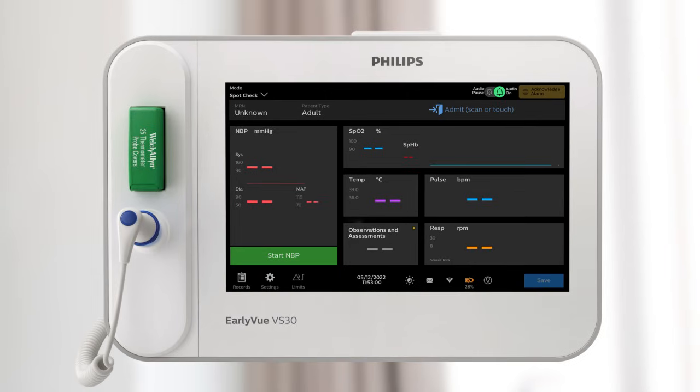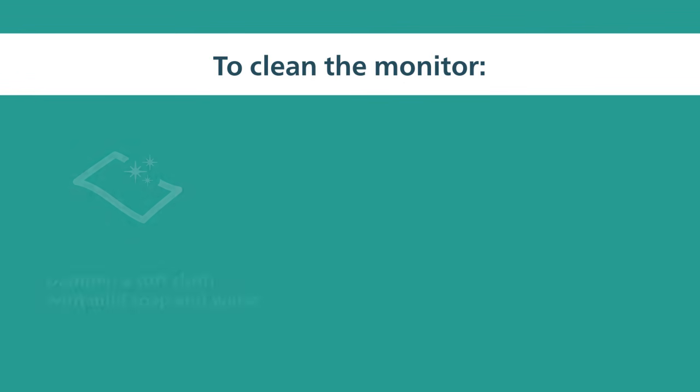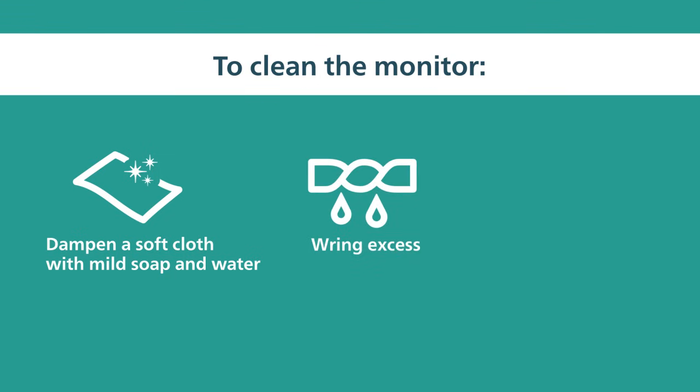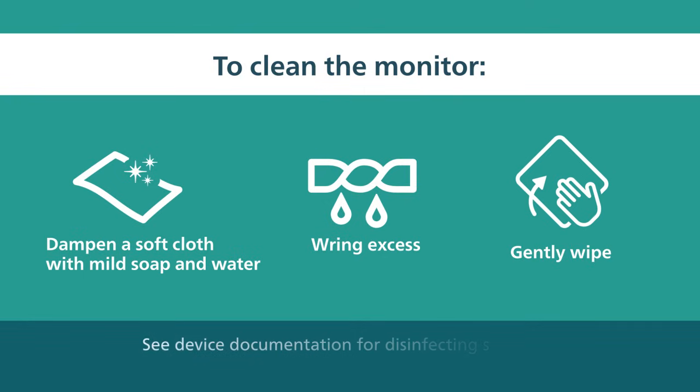The VS30's smooth front flat panel makes it easy to clean and disinfect. To clean the monitor, dampen a soft cloth with mild soap and water, and wring any excess before gently wiping the monitor. To disinfect the monitor, follow the same steps using one of the recommended solutions provided in your device documentation.